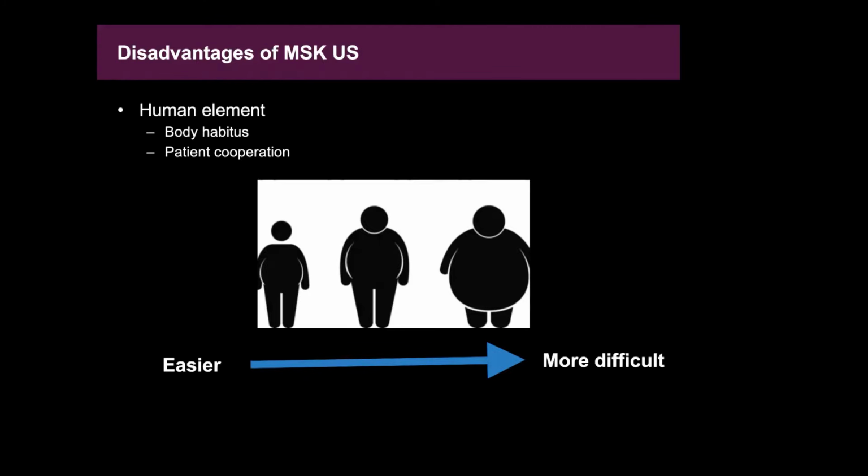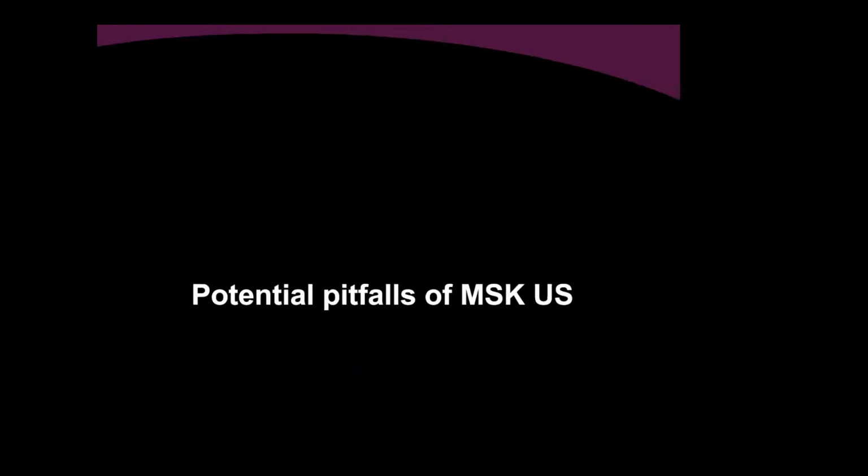When we're doing ultrasound, you're basically face-to-face with the patient. You really need them to be able to cooperate with you because you're moving their joints and their muscles in particular positions, particularly with dynamic exams. So you really need them to be able to follow your instructions and work with you. And you can see how this became a problem in the COVID era because it was very difficult to be face-to-face with the patients. And if you have, say, a demented patient or a very belligerent patient, MSK ultrasound may not be the best modality to examine the patient in those cases.